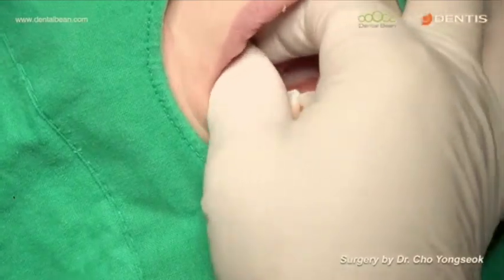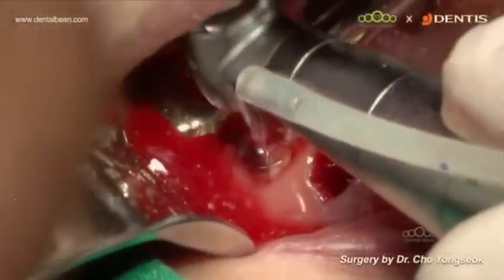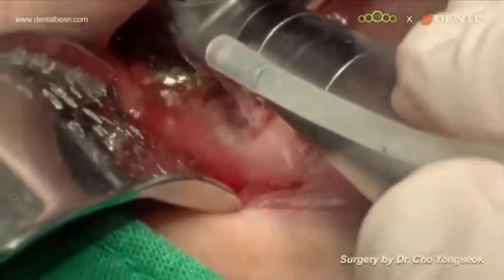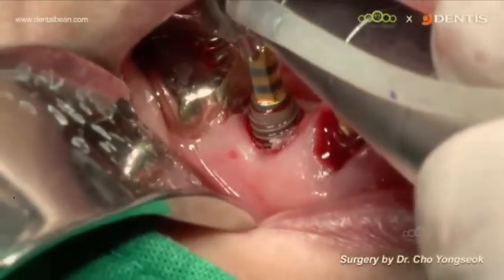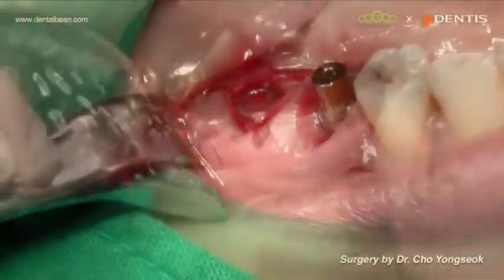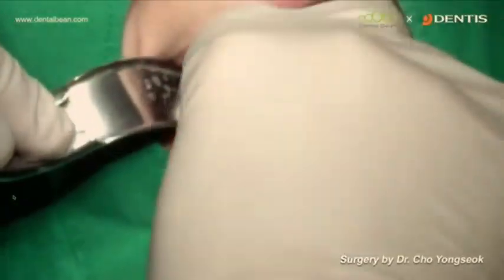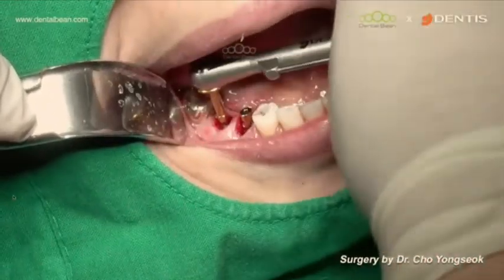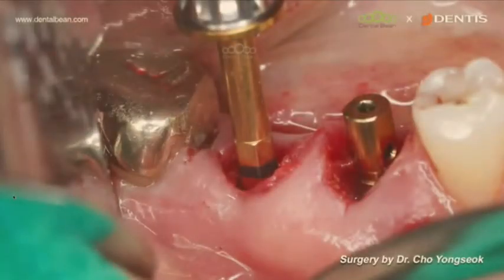Okay, it was really dense bone. D1 bone is not the same, actually. When it's really dense bone, we call that kind of bone marble bone. Okay, marble bone, and we need over-preparation in that situation, like in this case. I made a sufficient osteotomy and finally placed the implant.